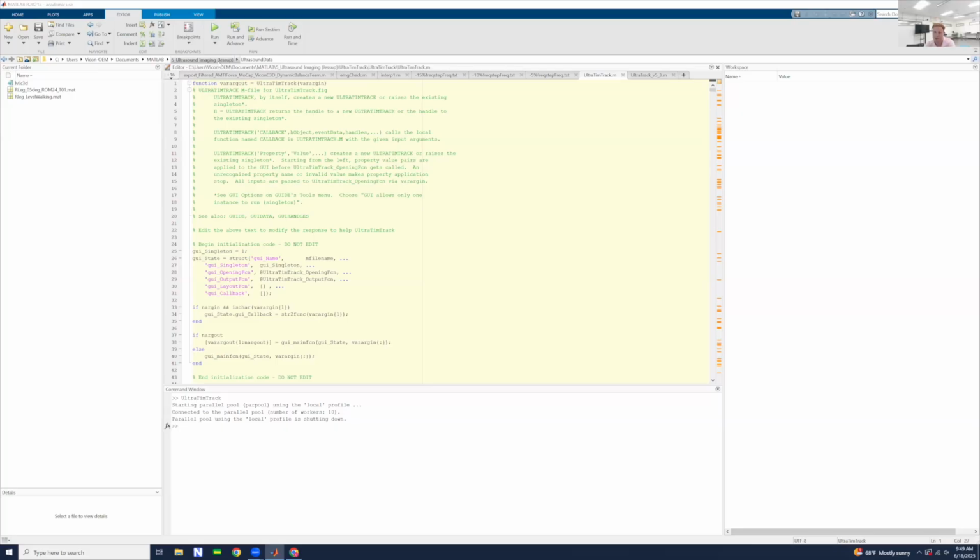How does the software choose a fascicle? Is there variability in the length changes among fascicles? This is something that I need to look into a little bit more myself for this UltraTimTrack stuff. This is a relatively new software. As far as I know, it uses line detection methods and will take an average of what lines are detected and select that as its fascicle, with the deep and superficial borders created by the aponeuroses that are detected.